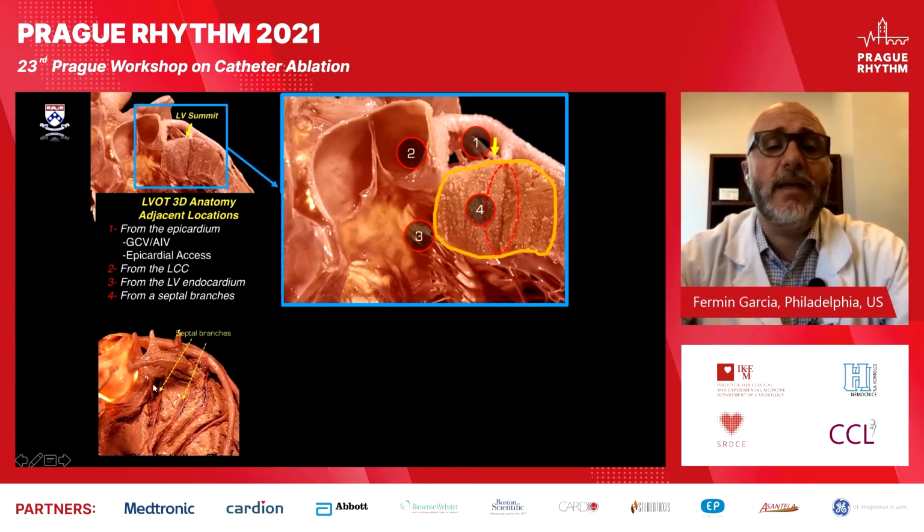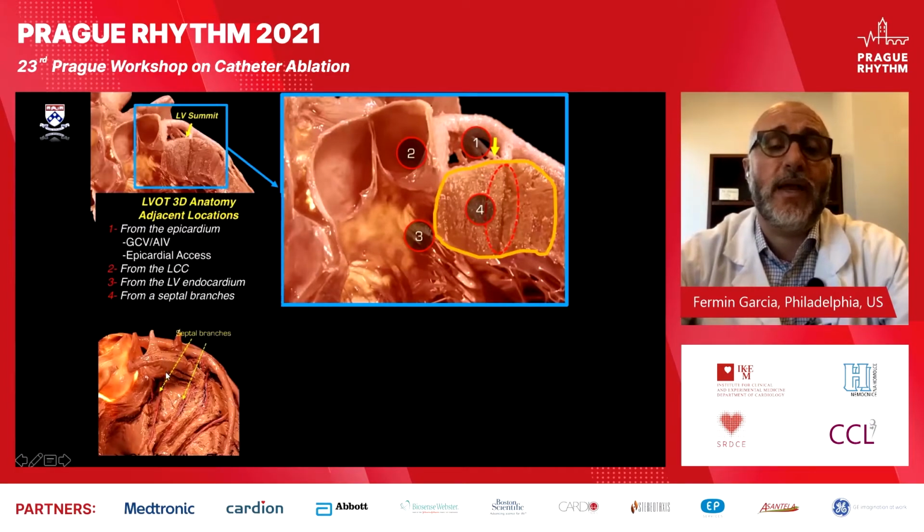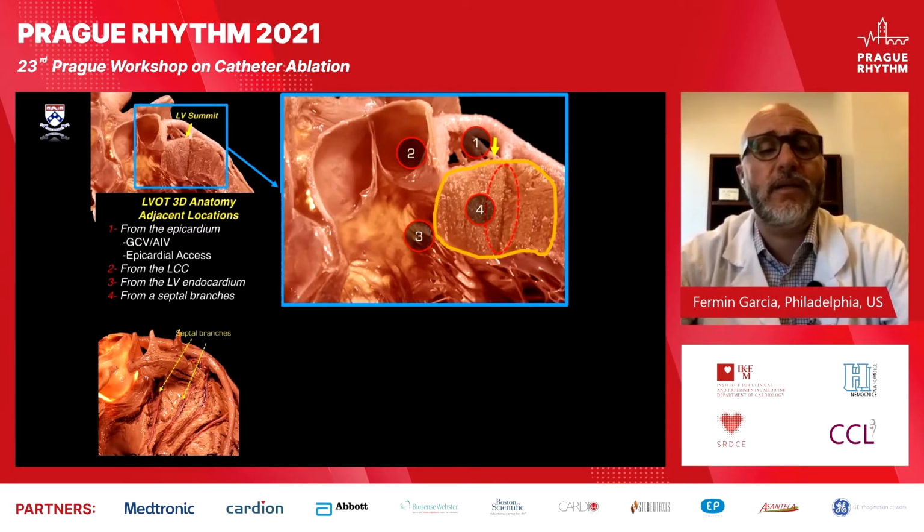Behind these septal perforators, or next to them, there usually is a venous branch. So you can do either venous or arterial mapping of the septum on the intramural aspect of the left ventricular outflow tract. We prefer to map the veins because they're forgiving, unlike the arteries, where if you caused a dissection, you would have a catastrophic complication.